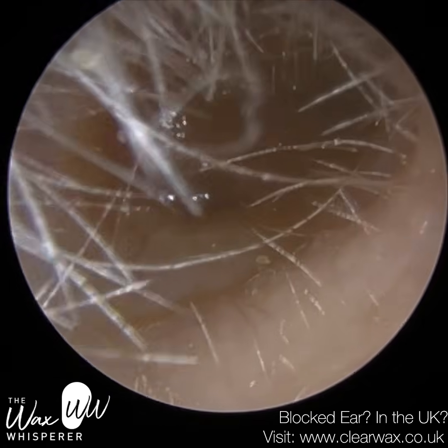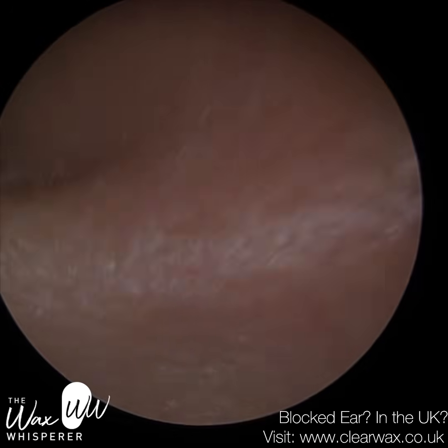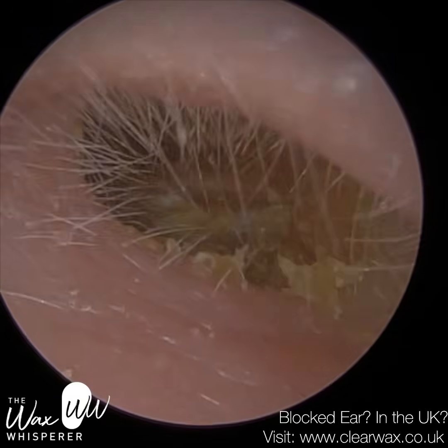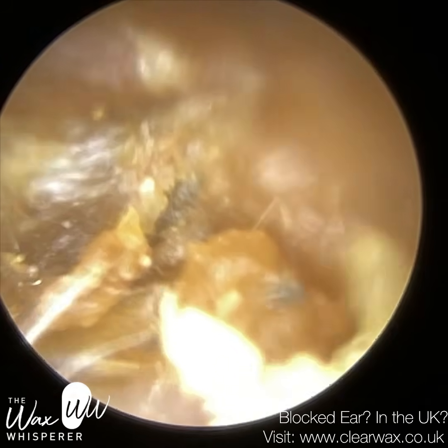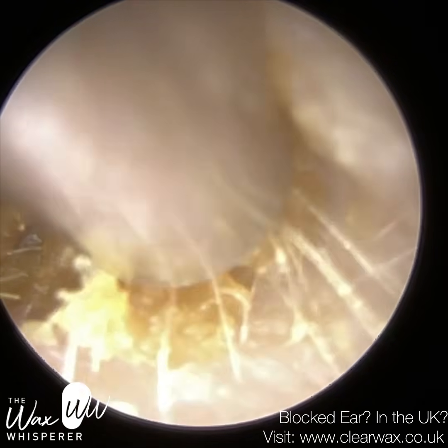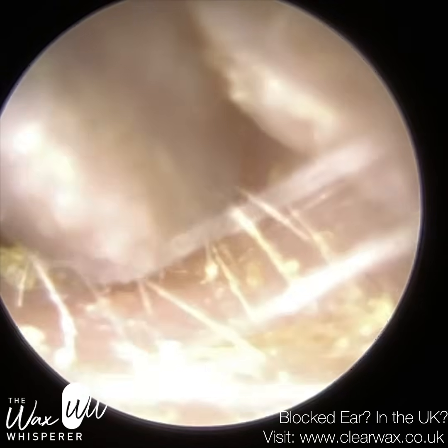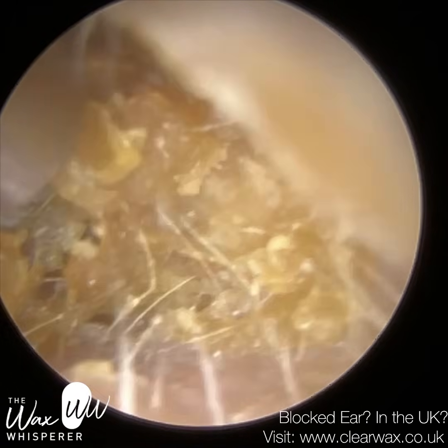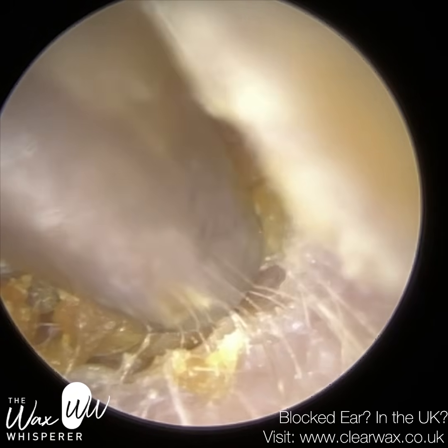We have here a patient who attended reporting bilateral blocked ears, and this is their left ear that we're commencing with. And in this ear, their occlusion is quite dry. It's not only earwax but a lot of dead skin, keratinous skin, and as you can probably see, the ear canal is quite inflamed. So they're suffering from superficial otitis externa.